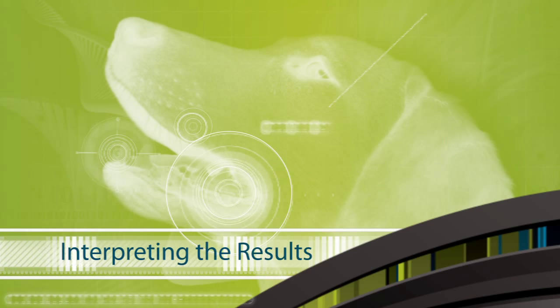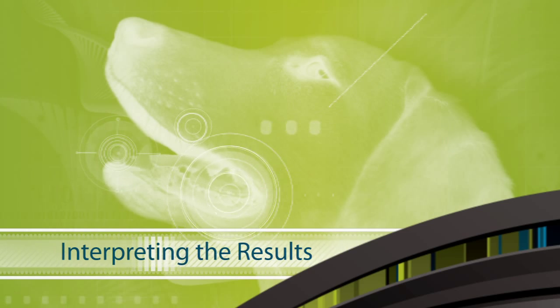Interpreting the results is easy. It's very easy to understand, very easy to read, very easy to show the client. They don't have to have much prior knowledge.